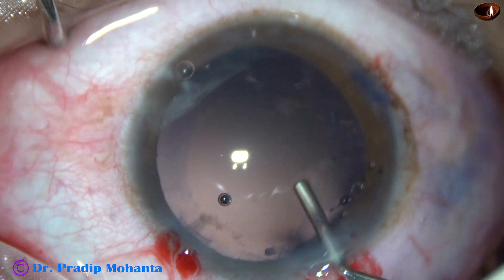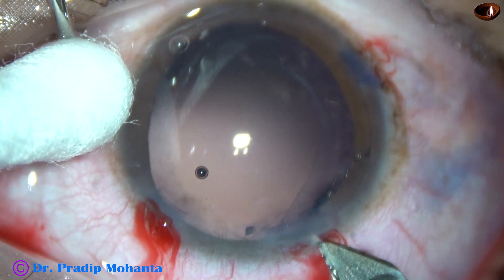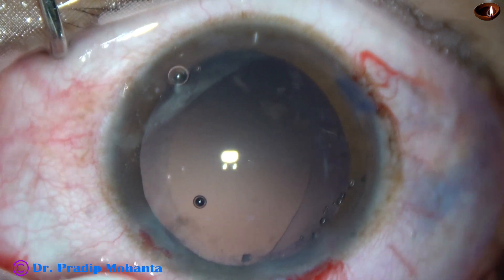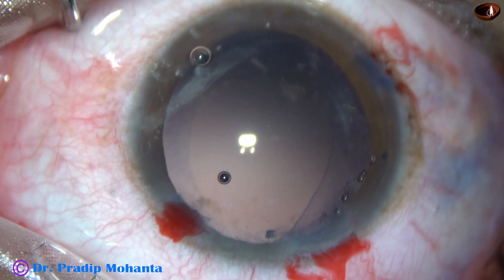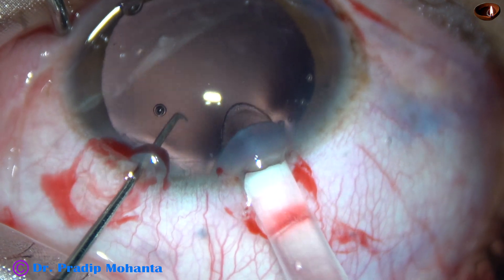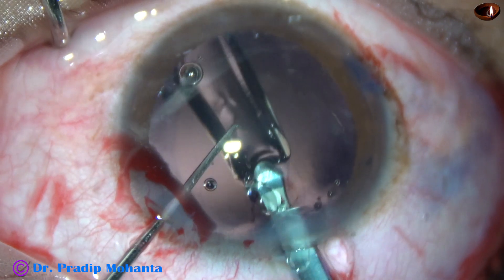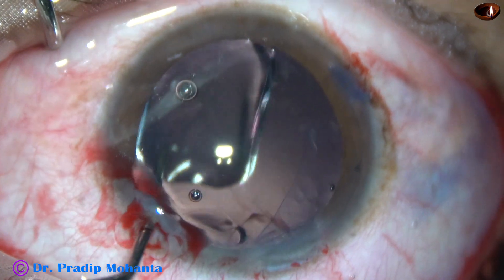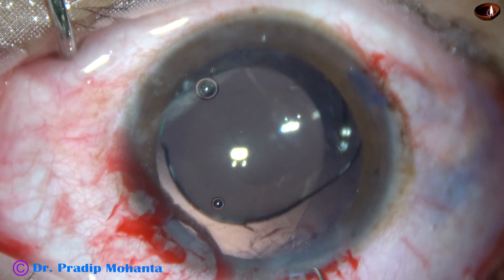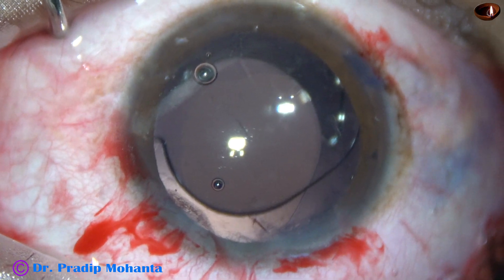And now the anterior chamber and capsular bag is filled up with viscoelastic. I am going to use a B-cartridge, so I need to enlarge the main wound to about 3 mm. The 2.8 mm wound is now 3 mm. And now a hydrophobic acrylic single-piece monofocal intraocular lens is being implanted. The leading haptic goes to the capsular bag. The trailing haptic is dialed with the left-hand instrument and placed in the capsular bag. The haptics are about 90 degrees away from the point where the rhexis has run out.